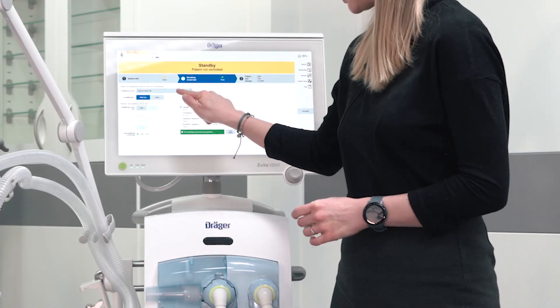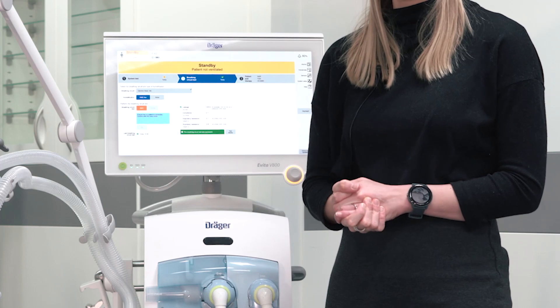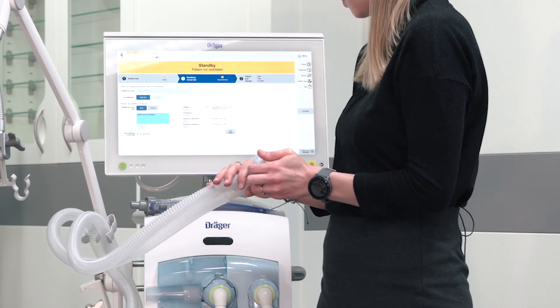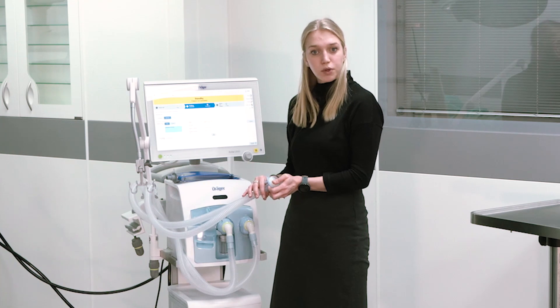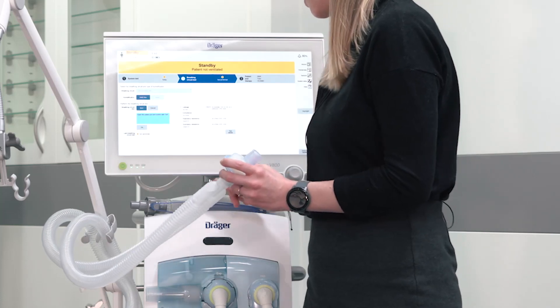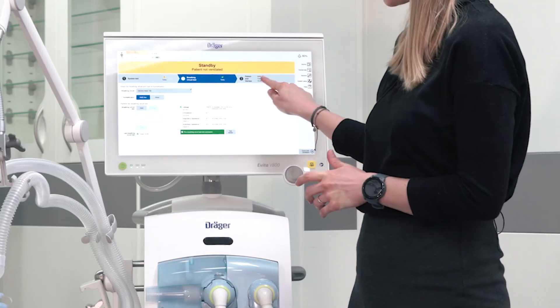To start the breathing circuit test, please select the use breathing circuit and humidification type. You can start the breathing circuit test and follow the instructions directly on the screen. The breathing circuit test determines the leakage, the inspiratory and expiratory resistance, and the compliance of the circuit system. After successful completion of the breathing circuit test, please continue with the patient admission.